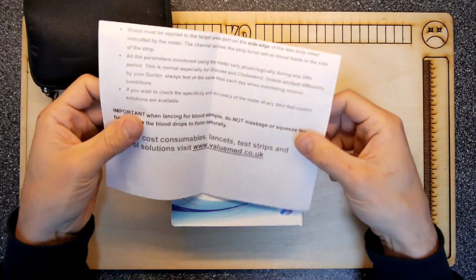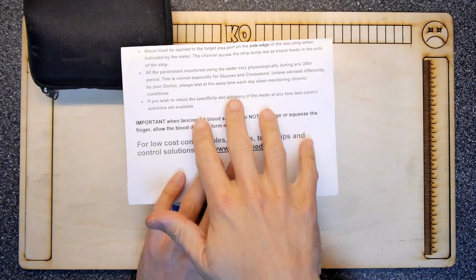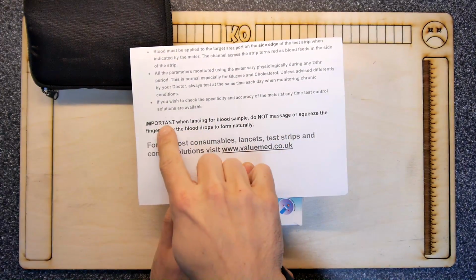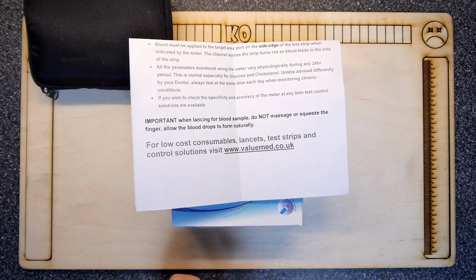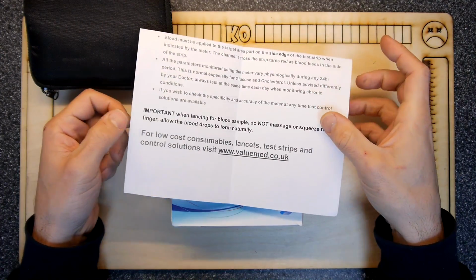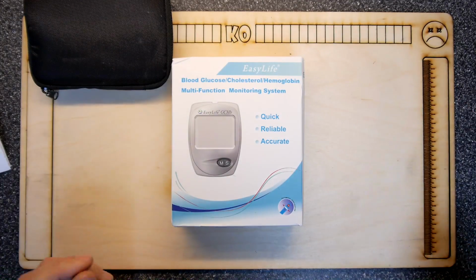Now it did come with this piece of paper that tells you how to use it, but it's stuff that's pretty much you should already know, but you could just read that if you want. But here, this is something that I never knew. It said, important, when lancing for blood sample, do not massage or squeeze the finger. Allow the blood drops to form naturally. Now, I don't think this is feasible, to be honest with you. We'll have a go today, but you know what? I'm normally squeezing that blood out.